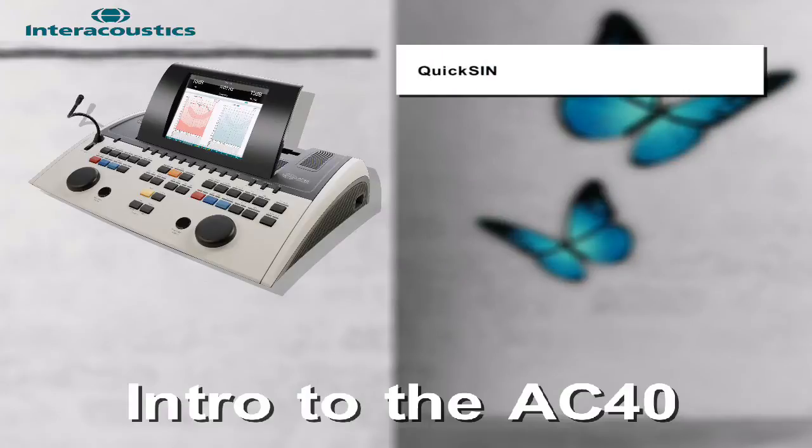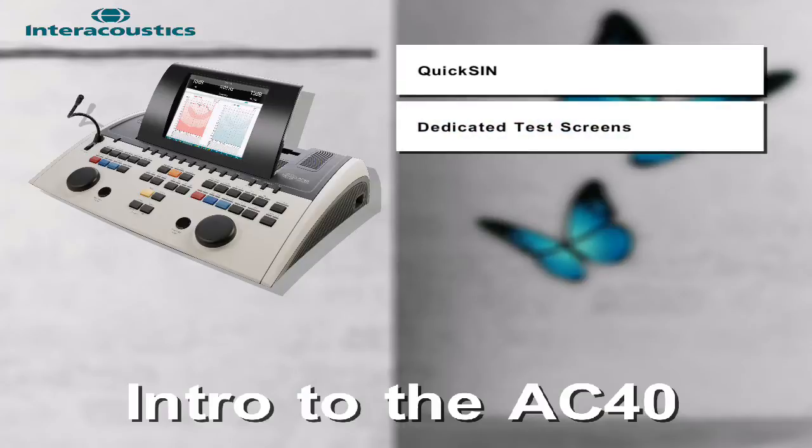The QuickSIN is loaded directly on the device, so an external CD player is not required. The AC40 offers a wide range of pre-programmed and dedicated testing screens which include TEN, Hughson-Westlake, Master Hearing Aid, Hearing Loss Simulator, and more.